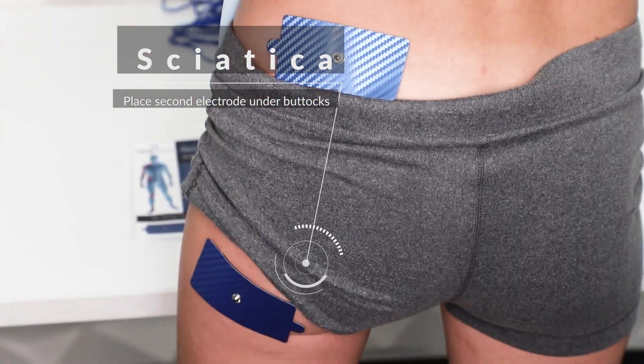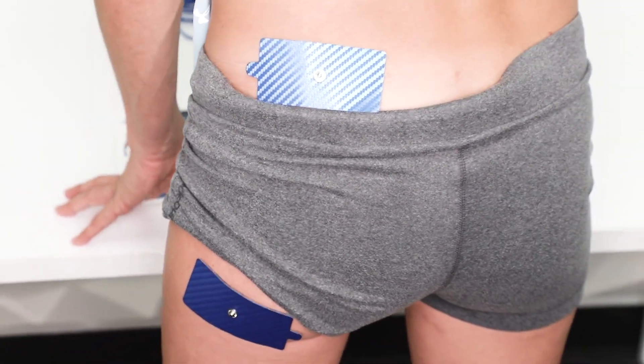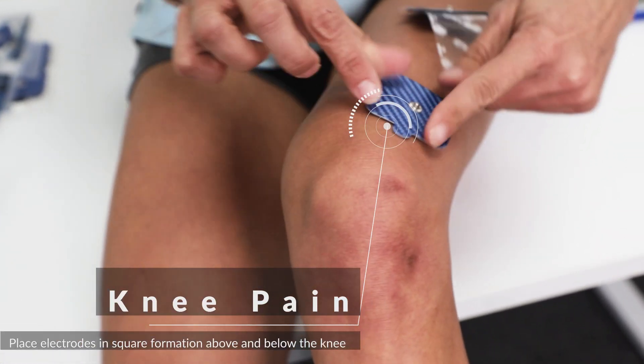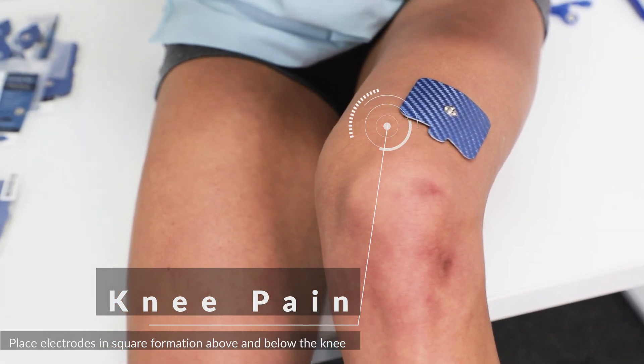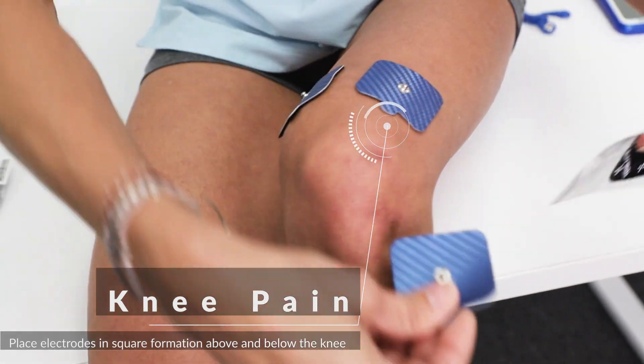Remember, there is no wrong placement. You want to make a formation with your electrodes around your pain area. For knee pain, use the same square formation as our previous steps, but this time place the electrodes around your knee.